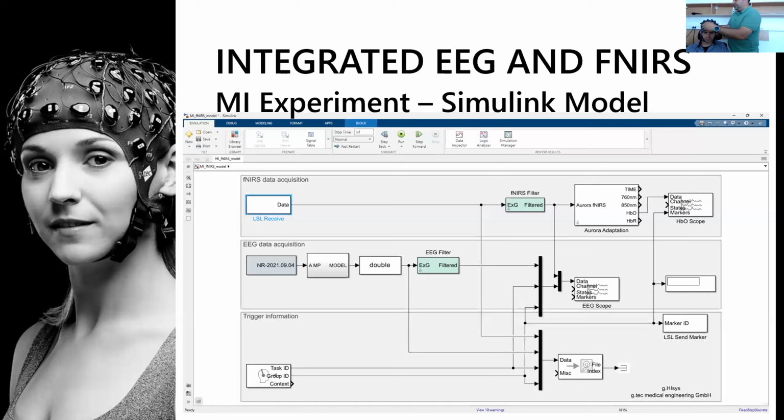Okay, so this would be the first step in setting up the cap, which is hybrid fNIRS with EEG. The optodes. I will take the camera and I will bring it a bit closer. So these are the sources with red and detectors with blue.